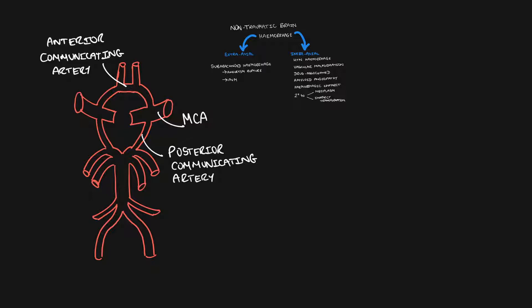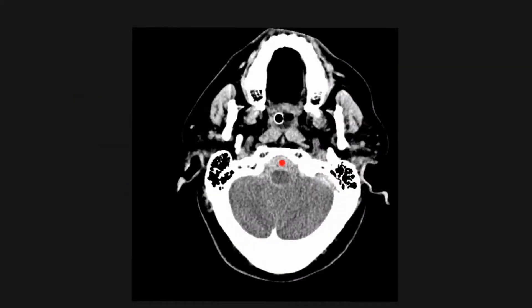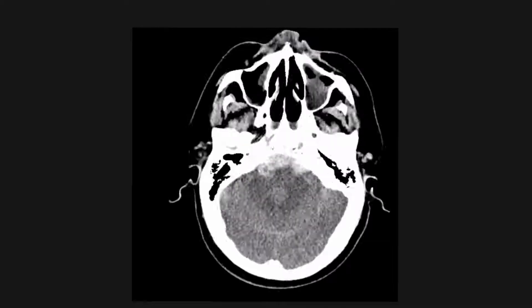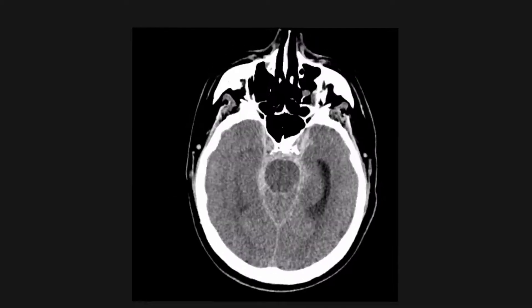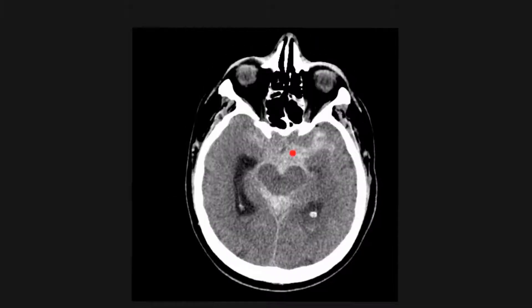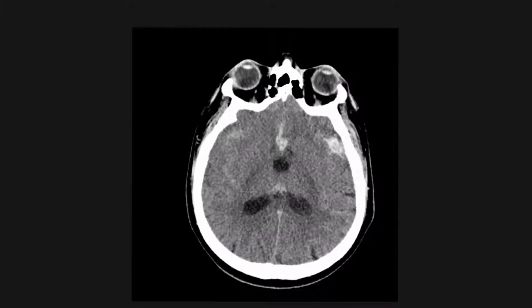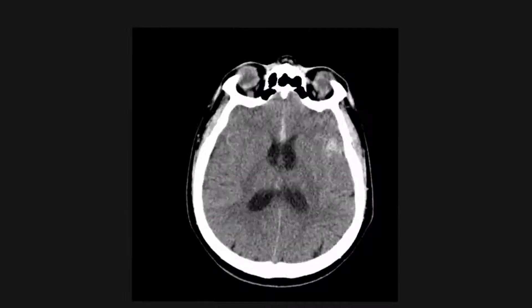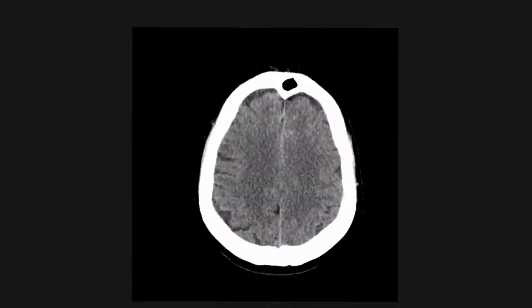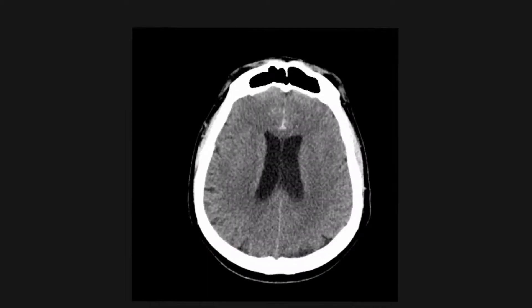Let's take a look at a few examples. Here we can see there is hyperdensity in the basal cisterns, also in the suprasellar cistern, and in the sylvian fissures. There is also some sulcal effacement. This is in keeping with an acute subarachnoid haemorrhage.